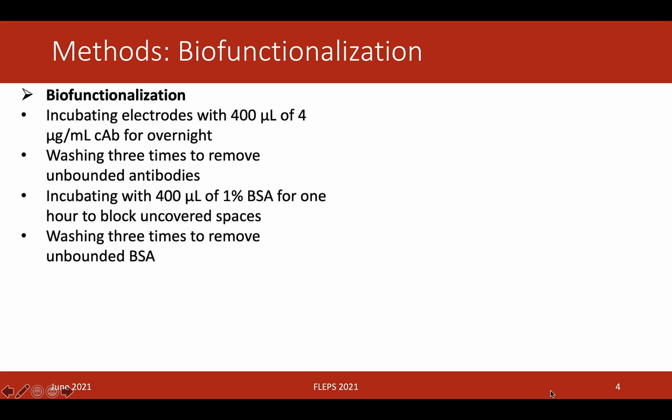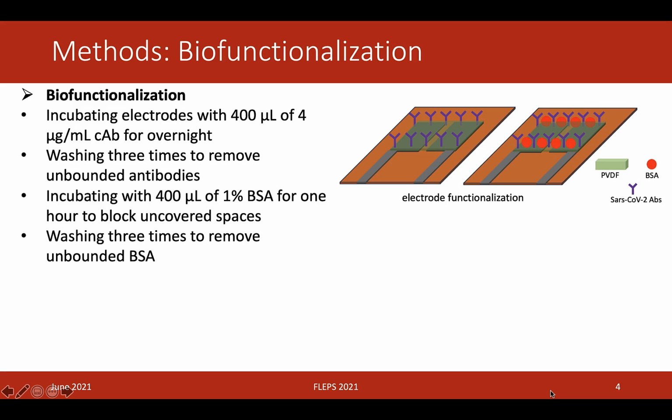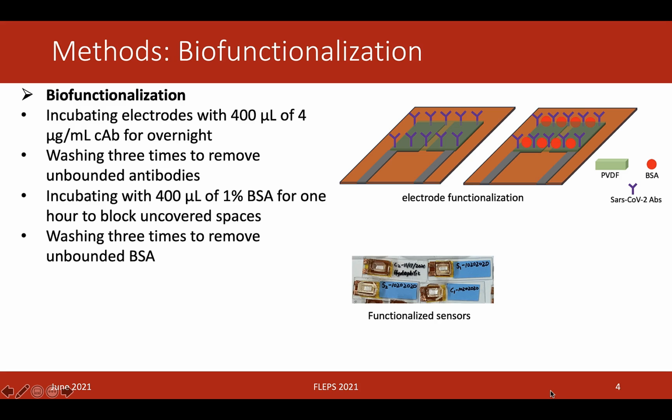So to biofunctionalize our sensors, we incubate the electrodes with 400 microliters of capture antibody overnight. The concentration of the antibody solution is 4 micrograms per milliliter. Then we wash 3 times to remove any unbound antibodies. Then we incubate the electrodes with 400 microliters of 1% BSA to block any uncovered spaces. And then we wash 3 times to remove any unbound BSA.